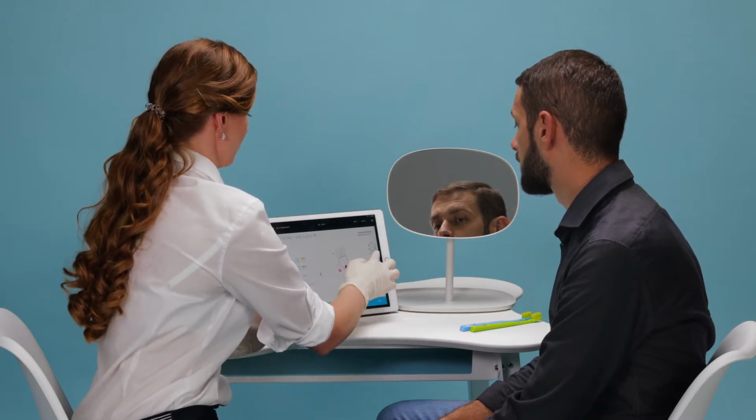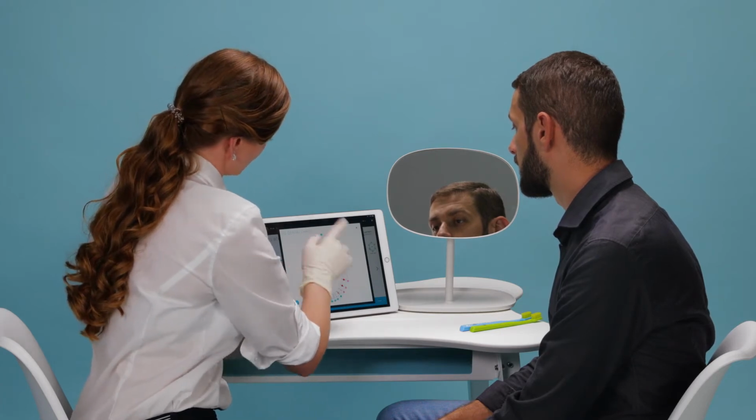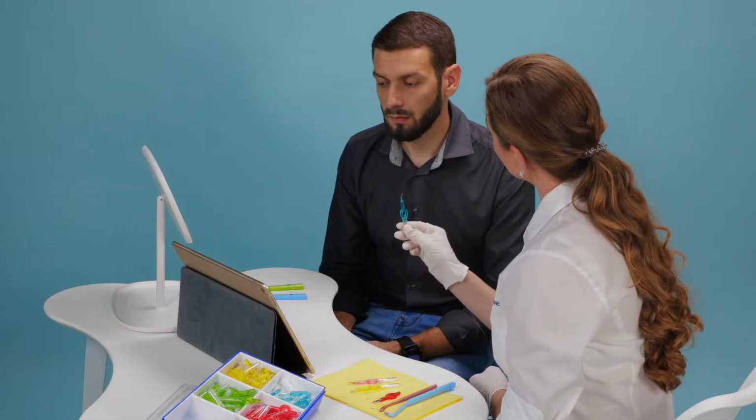Returning to the full overview of the mouth chart, I then changed the image of this mouth map into the patient's view and explained that he now will have 3 aids to use daily.